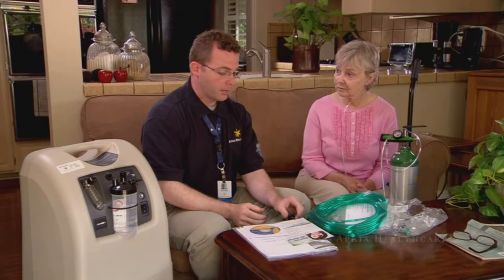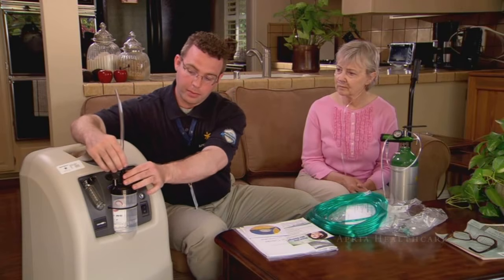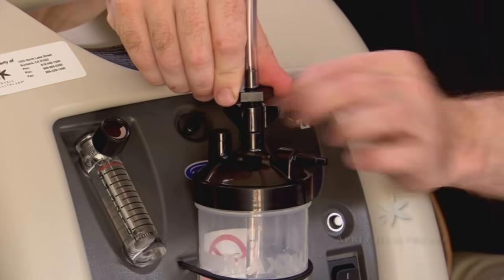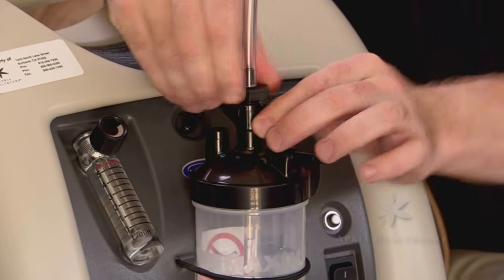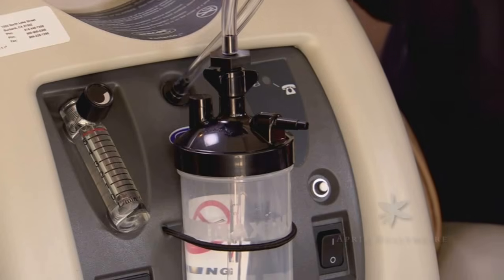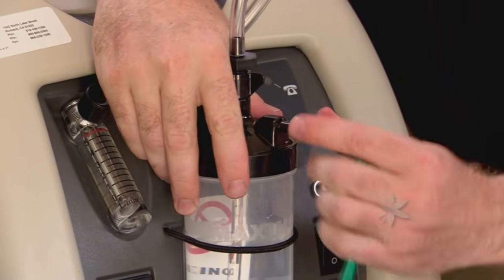First, center the threaded cap on the humidifier bottle under the threaded outlet tube on the concentrator. Second, turn the cap on the humidifier bottle until it is tightly screwed onto the outlet tube. Finally, attach oxygen tubing to the nipple outlet on the humidifier bottle lid.